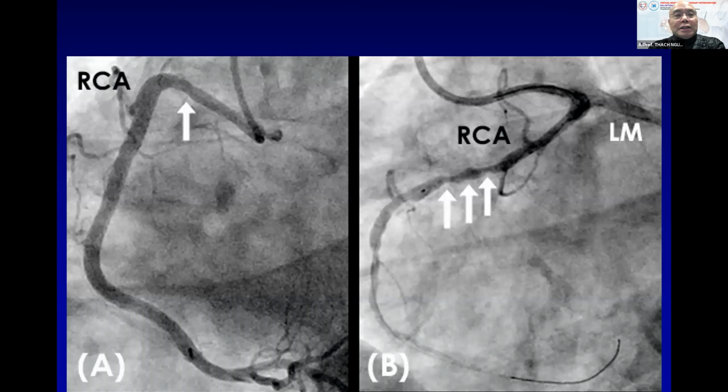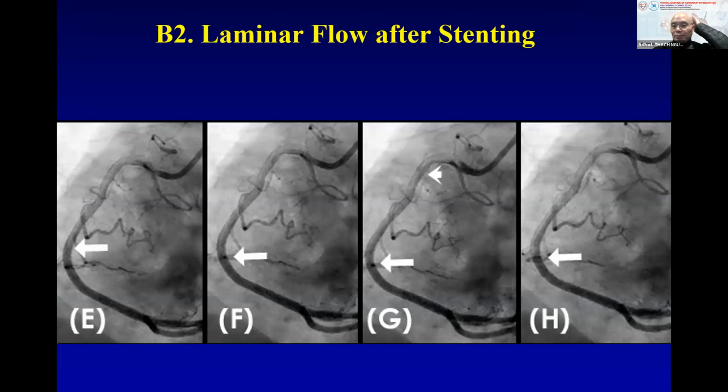And here it is. Let's say, for example, now the picture A. We see why this patient has the lesion in the proximal RCA, and the mid RCA and the distal RCA are clean. It is all due to anomaly of the ostium, of the orientation of the proximal segment. Similar in this patient, in B. This patient has lesion not because of the distal flow, but because of the anomaly of the coronary ostium. And at the end, I conclude my talk.